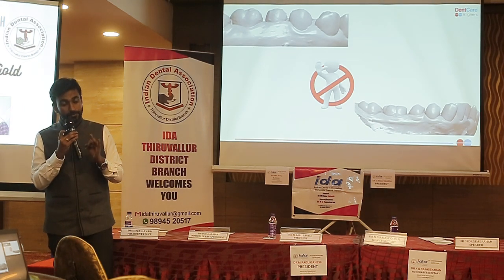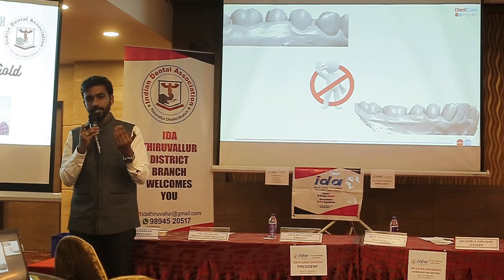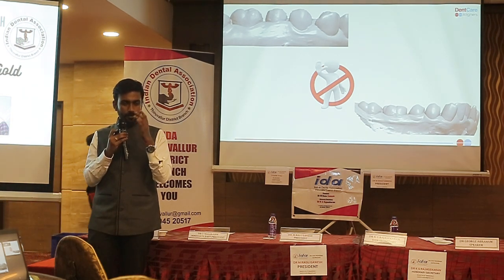Then the next one is, after doing the IPR, make sure you polish the surfaces well. Otherwise, that will lead to plaque accumulation, which can lead to proximal caries also in future. So polish it well.